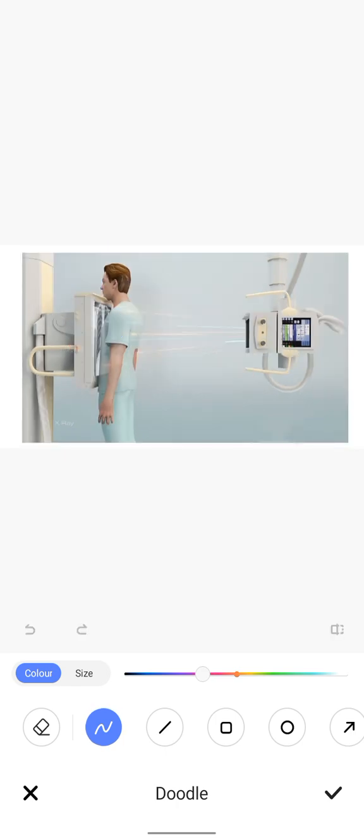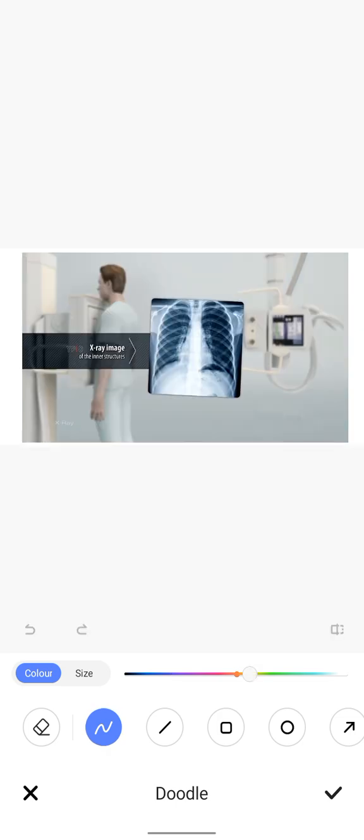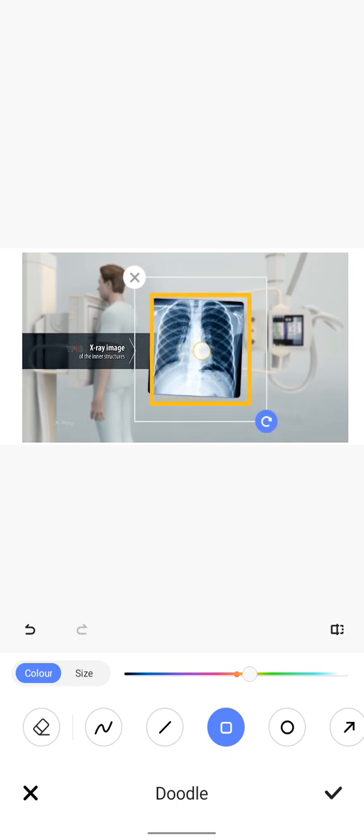This image is only for your explanation. You can see the information from the body is pasted over here on the detector, but on the detector the information of the body is not appearing, as I showed you in the previous video. This detector is connected through cables to the computer, the information from the detector goes to the computer, and the final image appears on the computer monitor. Suppose this is a computer monitor and the final information is displayed on the computer monitor.